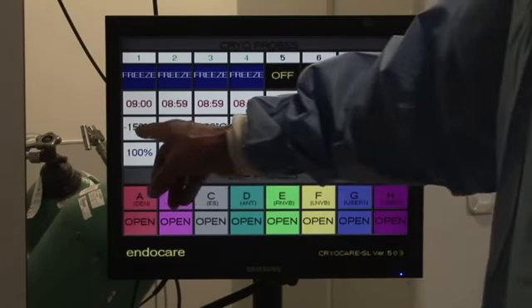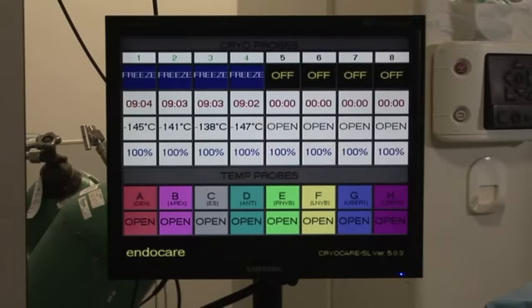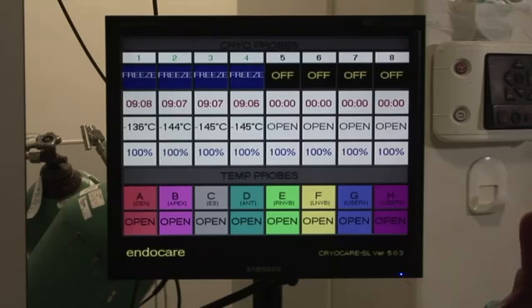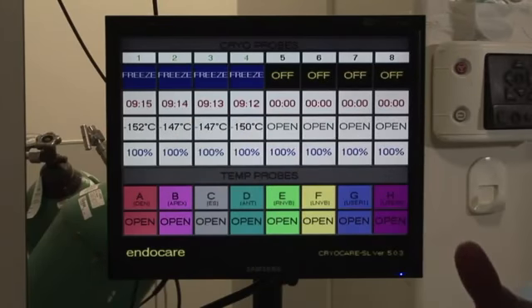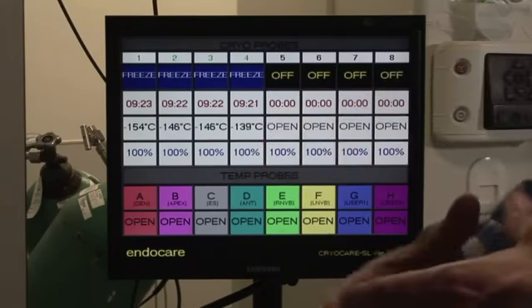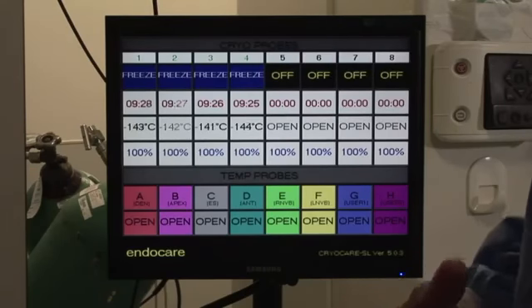You like to see these things running in the minus 130, 140 range. The probes which are closer to the parenchyma, the heated parenchyma of the kidney, will tend to be warmer. But again, with 4 probes, it's an overwhelming amount of ice power, and they're all going to run about the same efficiency and the same temperature. This temperature, I believe, is back at the hub of the catheter where the thermocouple is, it's even colder at the tip.